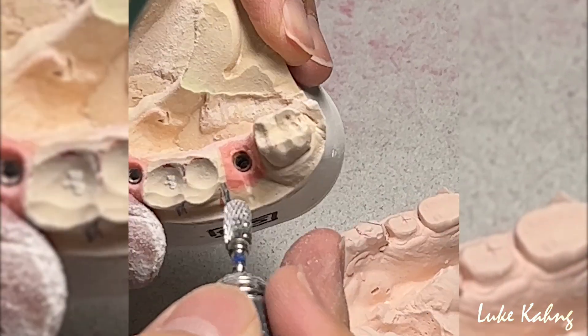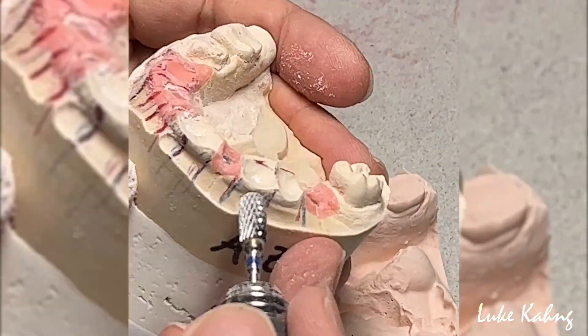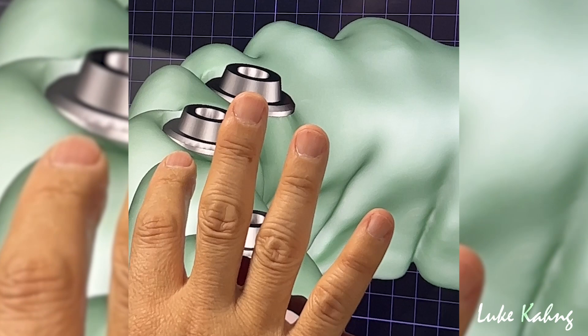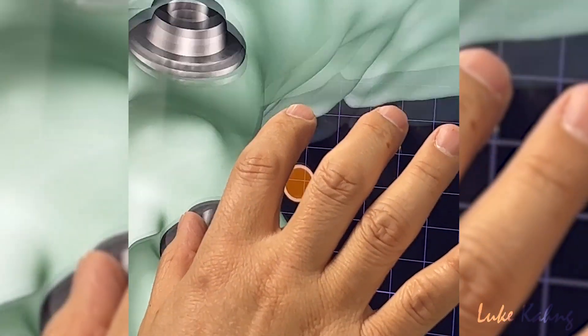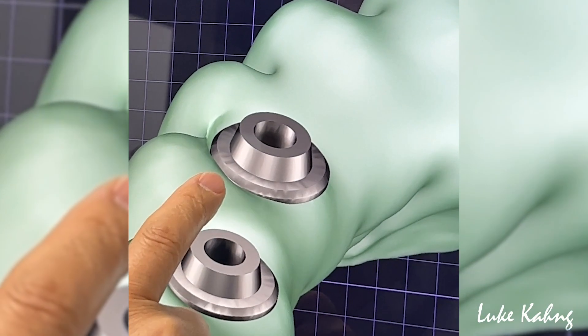Now I make the opening and try to make it out. This is pretty good. So now my technician can scan — for these cases you have to trim it. I need more football shape like this.